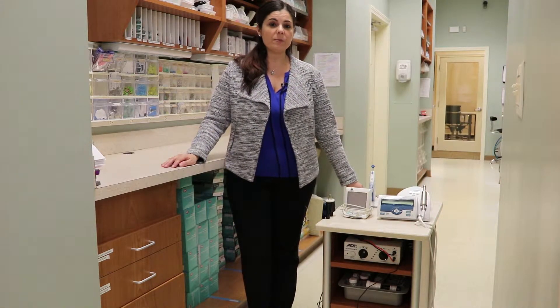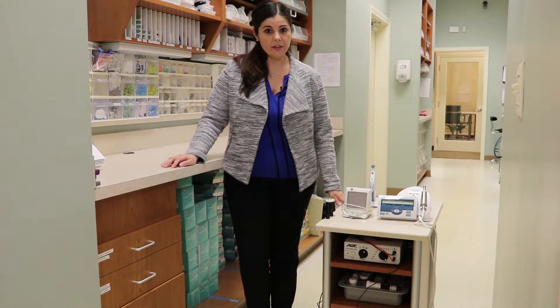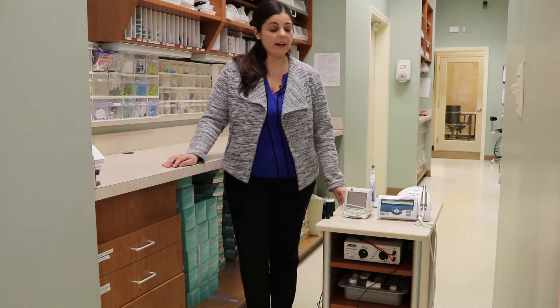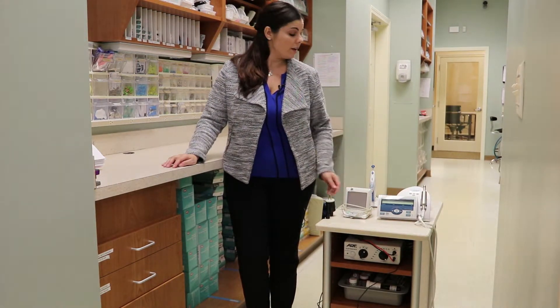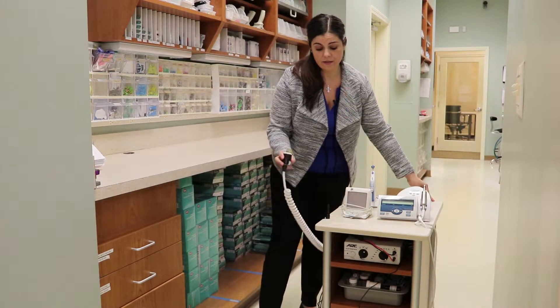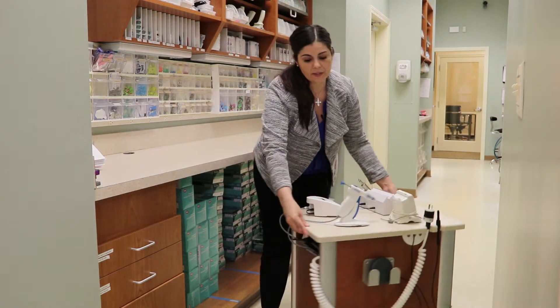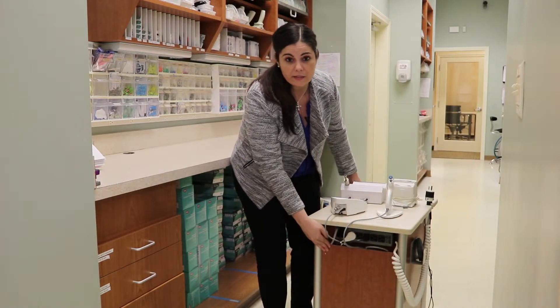Now we're ready to incorporate our technology into our endo cart. On top of the Corian here, you can plug in up to five items onto one power strip — items such as your endomotor, your apex locator, or even a backfill system. All of the items are fed to this power outlet right here, and all of the cords are nicely tucked away and hidden underneath this panel.